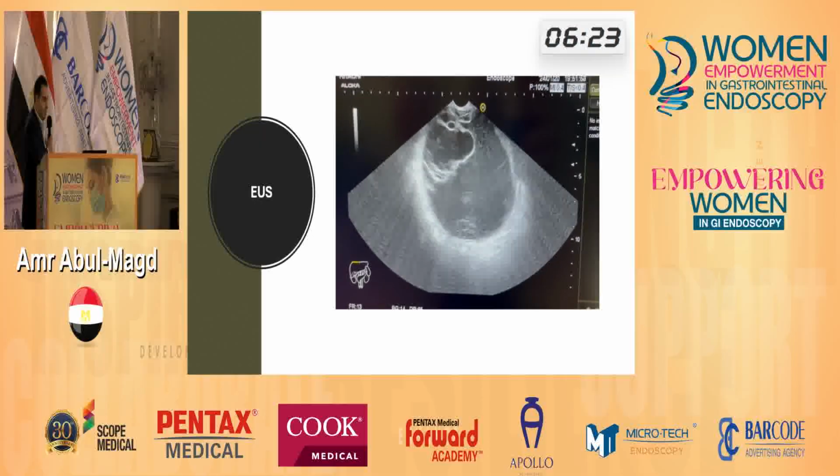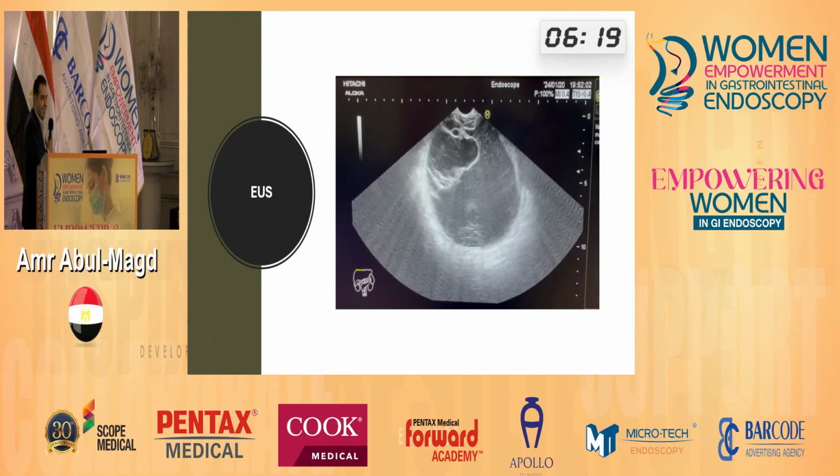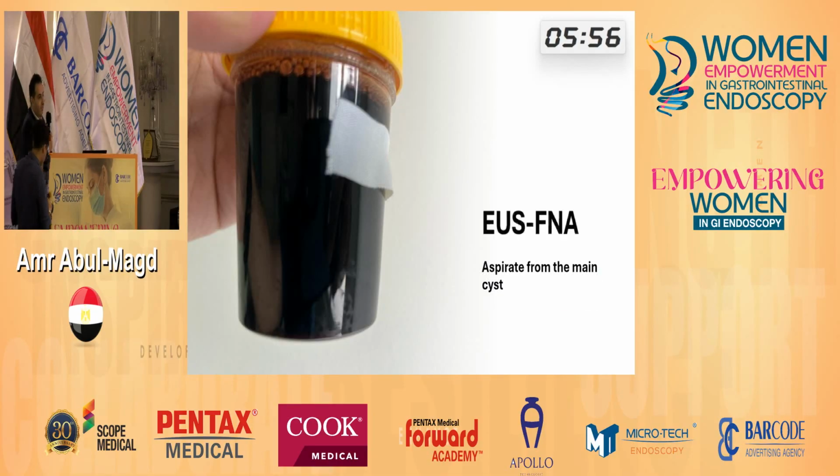Dr. Amr Al-Fouli, do it or not? You mean for draining? Drainage. No. This septation is not typical for drainage of a pseudo-pancreatic cyst. The wall is thickened. There are internal echogenic structures. In my opinion, it's not clear. Completely right. So I started to insert my needle, and this is what I found.